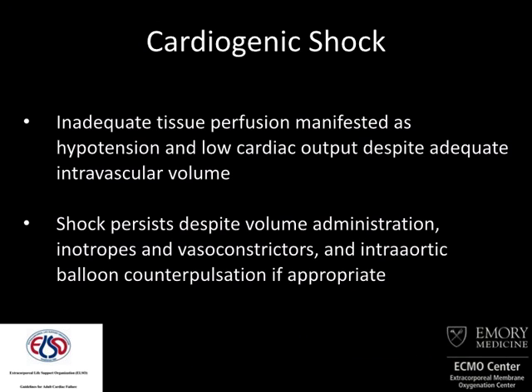So really, cardiogenic shock, what patient should we be using this? How are we defining cardiogenic shock? And there are some guidelines. The Extracorporeal Life Support Organization is the organization that is in charge of essentially development of ECMO. It was founded by Bob Bartlett back in 1988 and has continued to grow. And as you see, they have some pretty clear guidelines on management of patients.